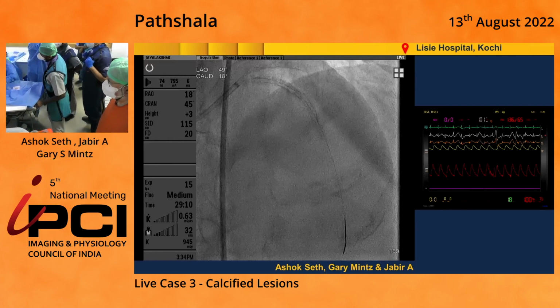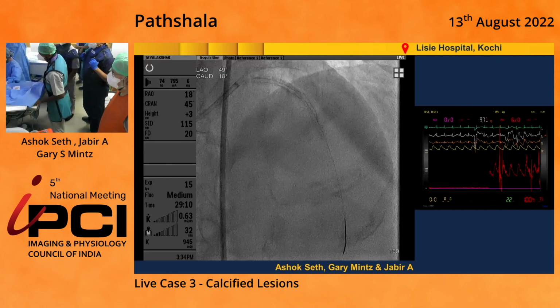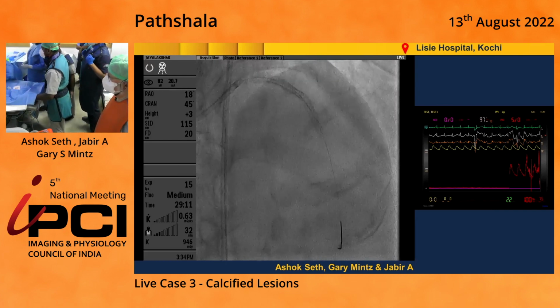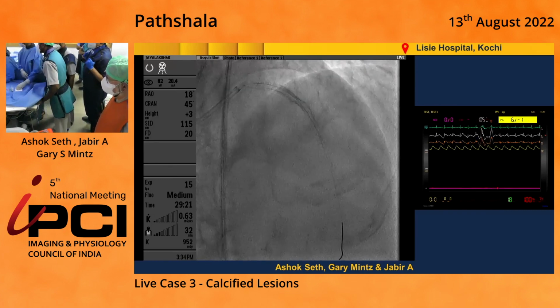Last month, there was a publication, probably the largest case series, specifically on one layer of stent and the use of IVL. They looked at 50 patients. It came out of France, and they found a 90% success rate with one layer. They didn't comment on two layers. At least anecdotally, I find that it works half the time and doesn't work half the time, particularly when we look at our brachytherapy patients.